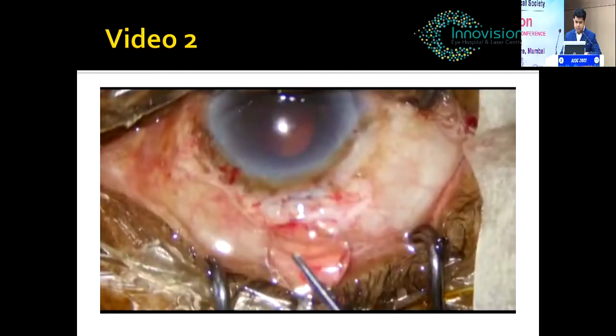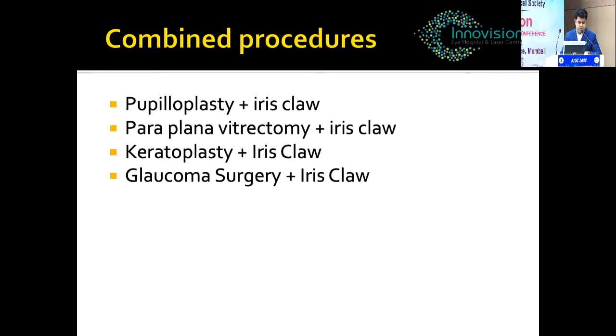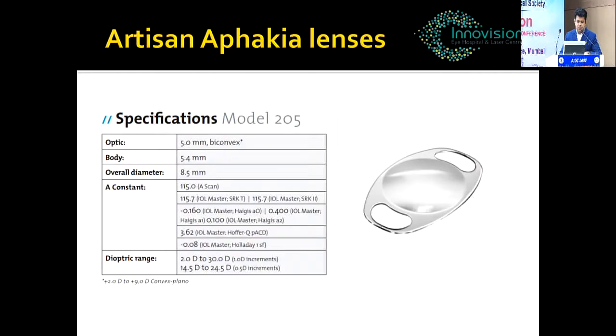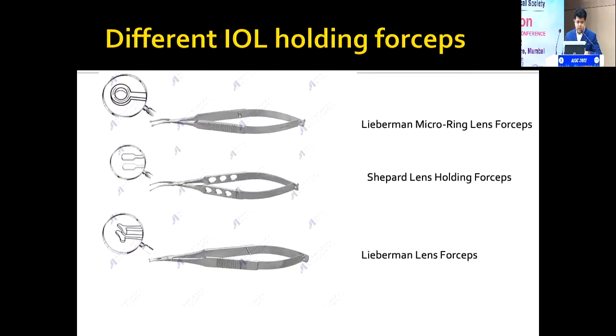Can we conclude? Okay, I think we have shorter time. These are a few of the lenses that are available in the market, and these are a few of the IOL holding forceps. I use the Lieberman forceps from Appasamy, the T forceps.